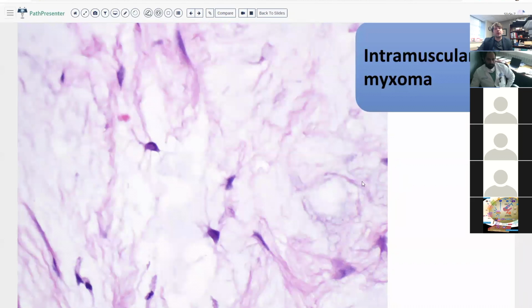And here's a closer look at the cytology of intramuscular myxomas. You can also see similar cytologic features in cutaneous myxomas: you tend to have either spindled or kind of bean-shaped, reniform nuclei. And they often have this little blob or pot belly, as Mark Edgar, one of my soft tissue mentors, loved to say, this kind of pot belly of pink cytoplasm. I think he just said bellies of cytoplasm, but for some reason I like the idea of pot bellies better, and so I morphed it over time in my memory.